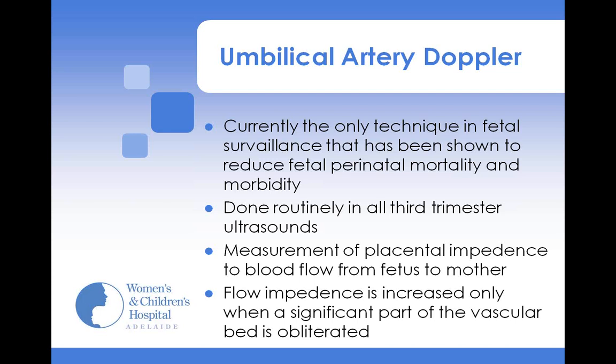fetus to mother. And of note, for the umbilical artery Doppler to be abnormal, the flow impedance needs to be significantly compromised. So a significant part of the vascular bed will be obliterated. I think it's about 75% before an umbilical Doppler is abnormal.